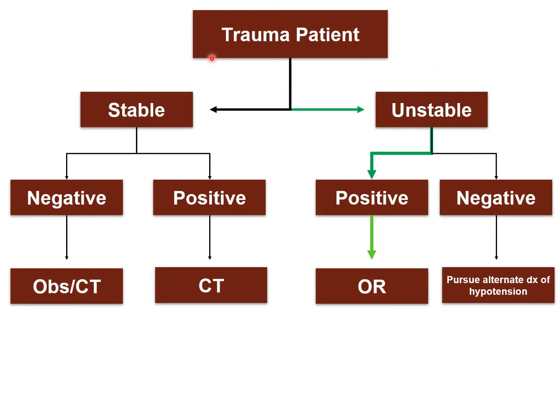Now, stable trauma patients who get a FAST exam are a little bit of a different situation, because the truth is stable trauma patients with either a positive or a negative FAST might end up getting a CAT scan. And it's not really going to change their management in the same way. You might see us do it, you will see us do it, on every trauma patient. And there's a few different reasons for that. It's not that we've forgotten its role in this algorithm.